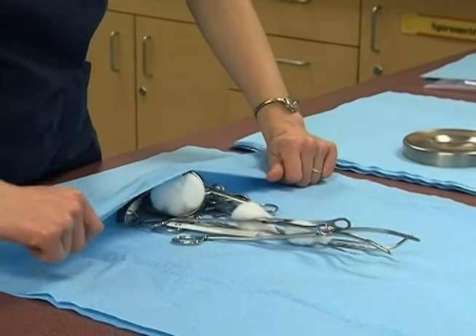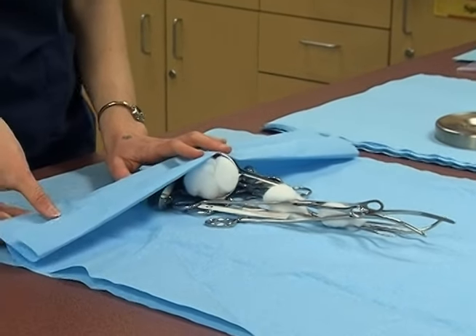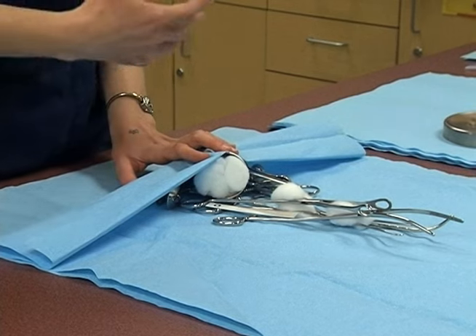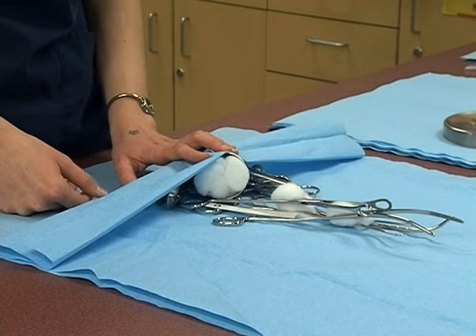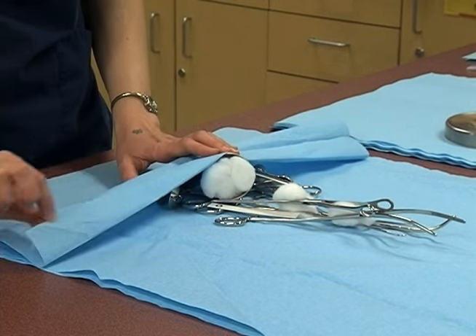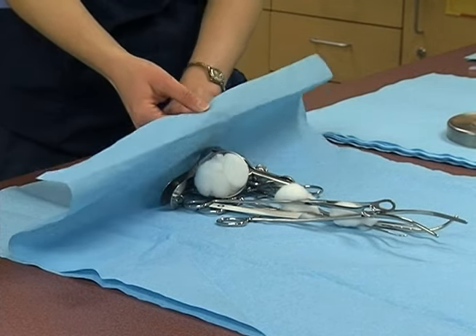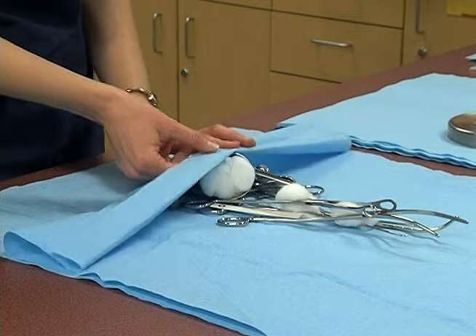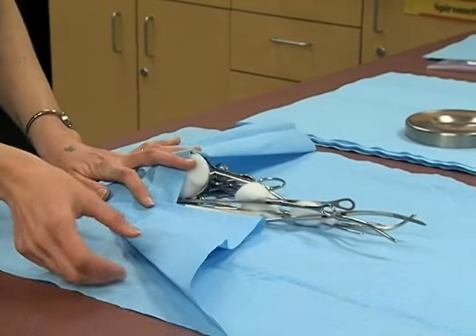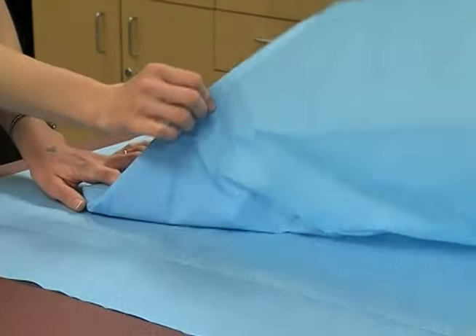Okay. When we're folding them, it will be based on the size paper that we have and the tools that we're folding. The general idea is that we want to make a kit that can be easily opened by the physician without compromising the sterile nature of the tools. So we make these little lips so that someone can go and grab it and pull it in that fashion without ever touching the inside of the kit. I like to get rid of some of the excess paper by folding it up like that and then coming over.